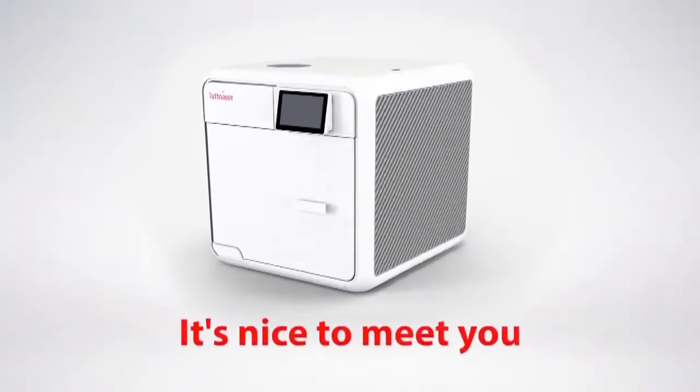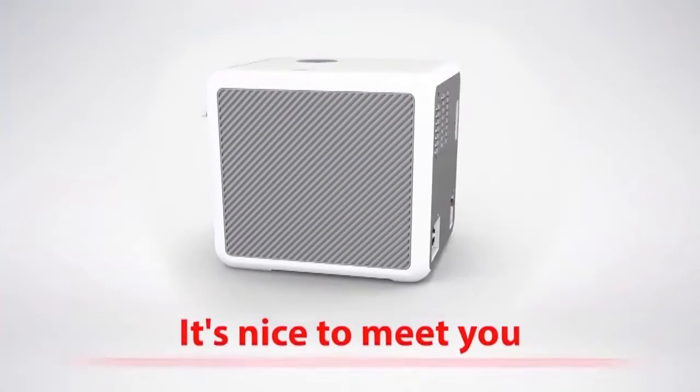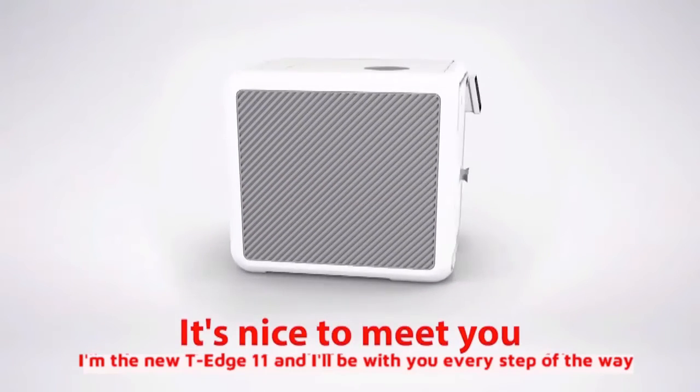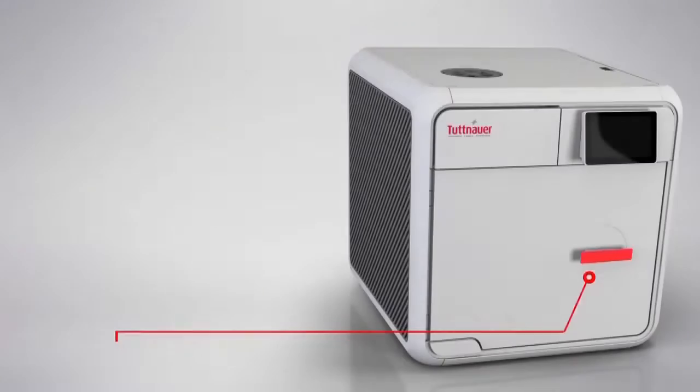The fully automatic gravity class S autoclave, upgradeable to class B pre/post vacuum sterilization autoclave, designed for dental clinics and small medical practices.